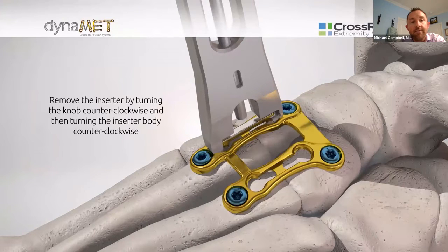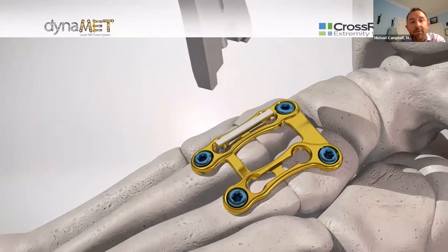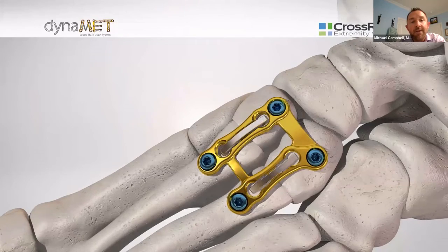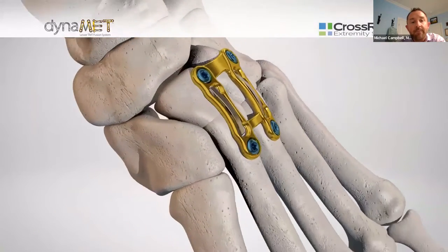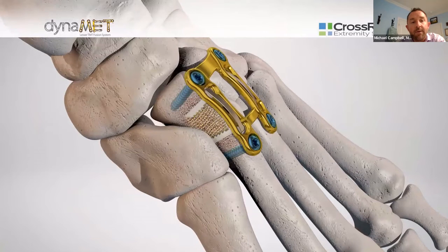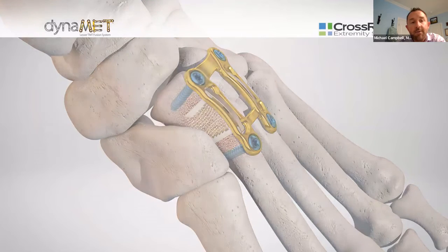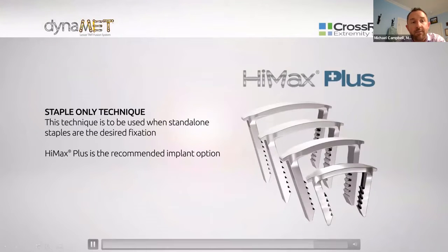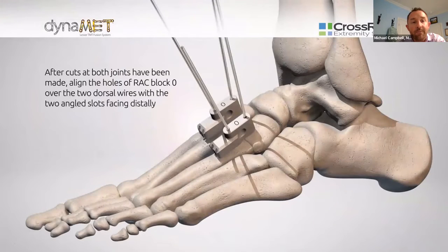And the staple goes in. This inserter keeps the staple extended until it's fully inserted, with the exception of the last millimeter that you then drive in with a little tamp. And when you're done, this is what your construct is going to look like. It's low profile, extremely stable, and really, really small. You can get 2 points of fixation in a relatively small cuneiform bone.